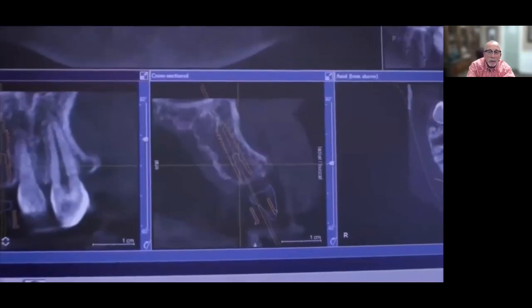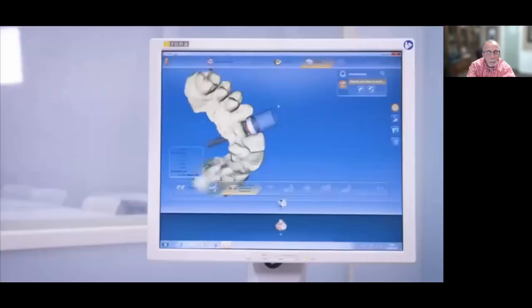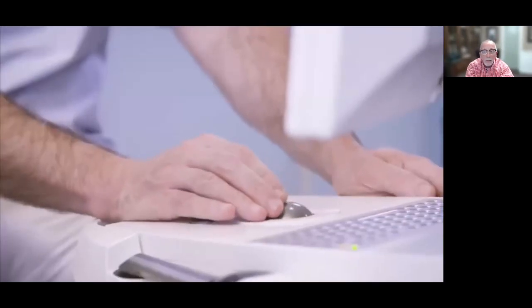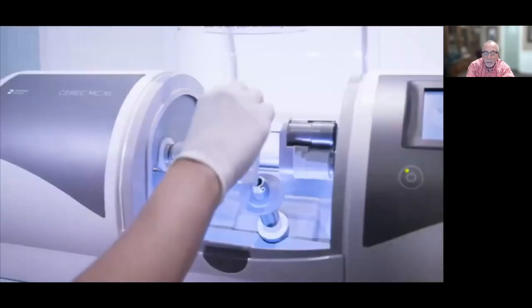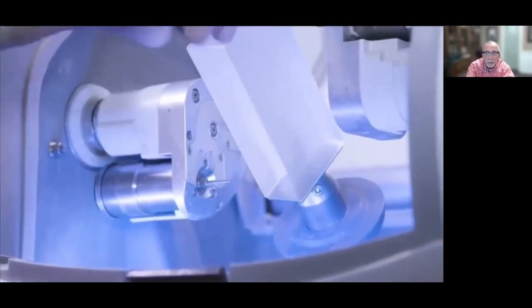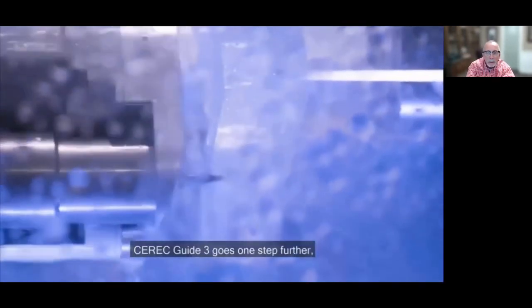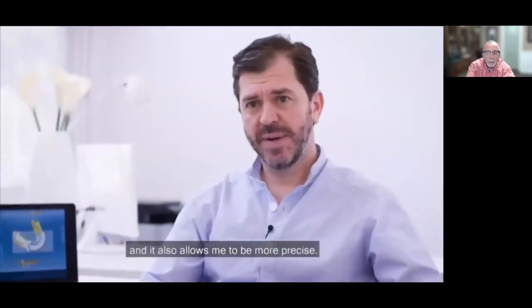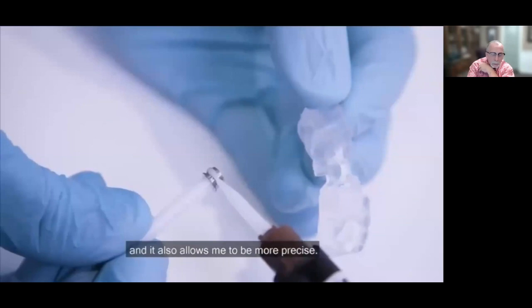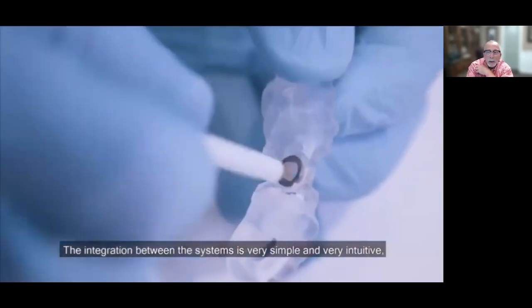Now, from that software, we can say, okay, let's make sure we get it right. So the software will actually generate the guide for us, same software. And we can actually mill that out of an in-office mill. If we want to do all this, again, 7-8% of you out there are doing it, and that's okay. The majority of you would rather have some technician help on that, but it's okay. So you mill the guide, you put the sleeve in, and then you're ready to bring the patient back in and place the implant, right?